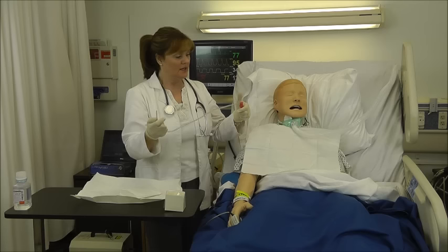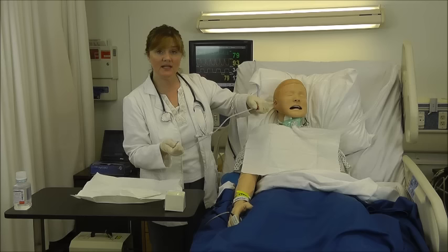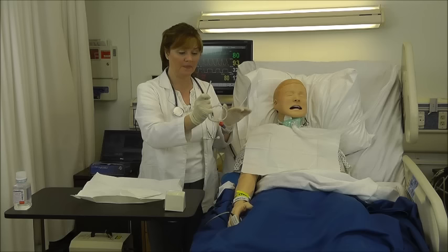Then I'll test the suction catheter itself to make sure there are no holes. When I occlude this space on the suction catheter, that's what creates the suction. So I'll put this into the normal saline, and you can see that the suction is working. In order to protect the tubing from hitting something as I'm moving around, I coil it with my pinky. You can also wrap it in your hand, just so it's not swinging and getting contaminated.